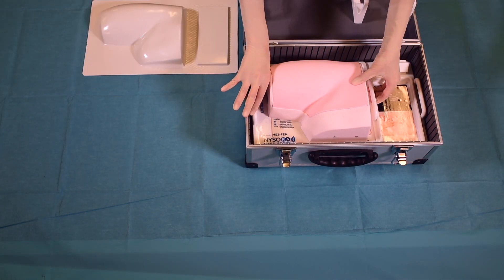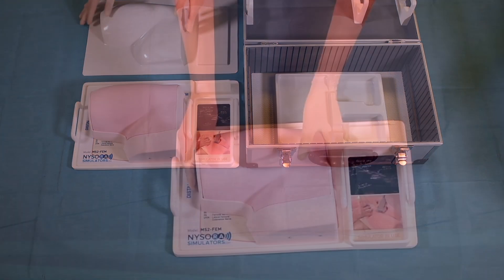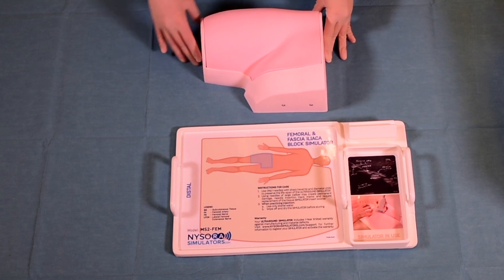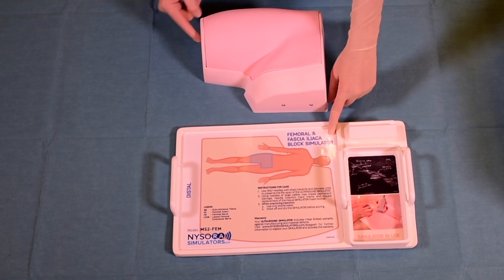Nysora Simulators are packed in a convenient box. To start using the Nysora Simulator, open the box, take out the simulator and place it onto its designated tray. As you remove the model, you can see that the model perfectly fits onto the labeled piece on the tray.